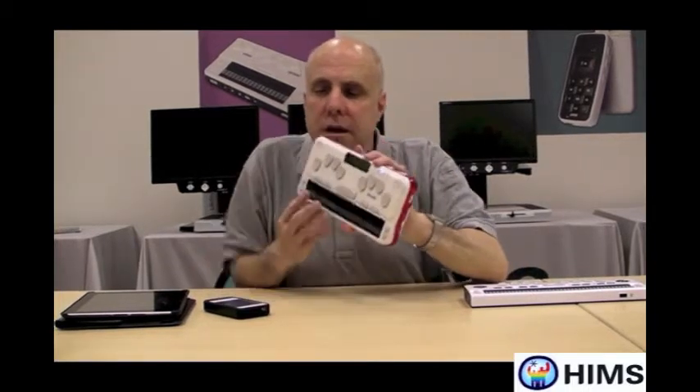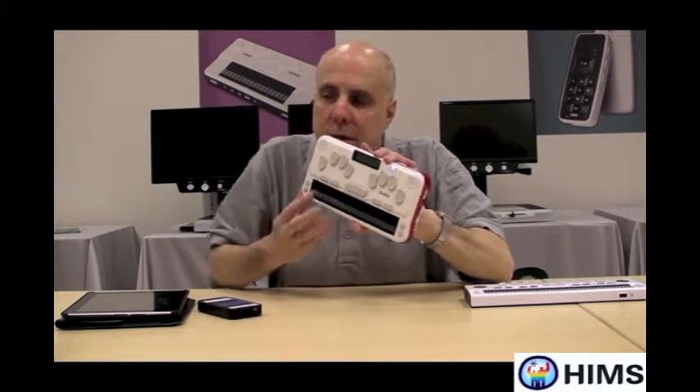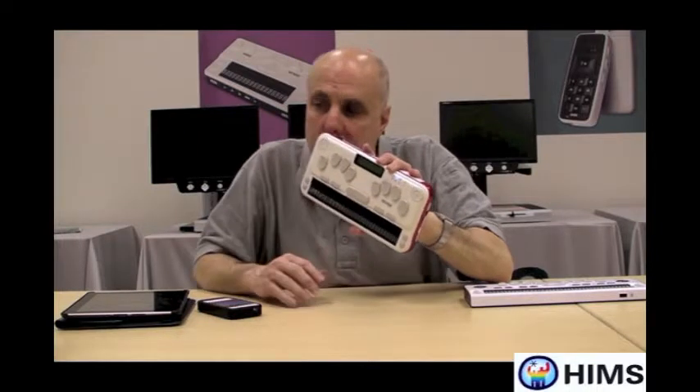First, we need to tell the iPhone that the BrailleSense U2 is available as a Braille display. So the first thing I'm going to do is make sure the U2 is turned on, which it is. I'm going to press the letter U for utilities, then press the letter S for terminal screen reader mode — S as in SAM. The first item that pops up is Bluetooth serial port. I'm going to press Enter on Bluetooth serial port, and the U2 said 'connecting terminal mode.' That's all I need to do — press that sequence of keystrokes and we're ready. You're now seeing terminal mode in Braille on the U2.